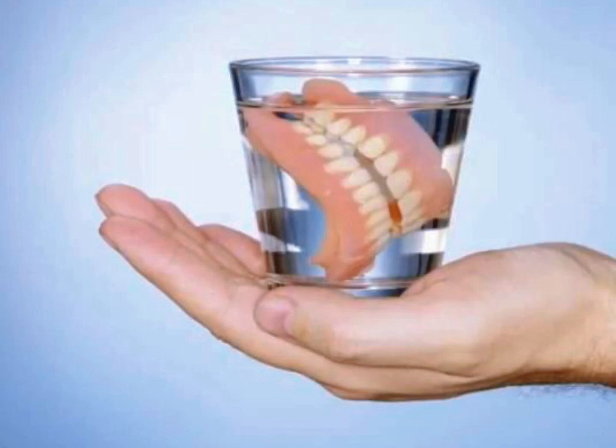Storing your dentures properly is also essential. Keep them in a container filled with water, like I've said earlier, when you're not using them, to prevent them from drying out. Some people, when they take out their denture, just keep it in an open place. No, you only store your denture in a cup filled with water. Store them away from pets, as they might be tempted to chew on them. The material used to produce dentures can be tempting, so keep them away from your pets.